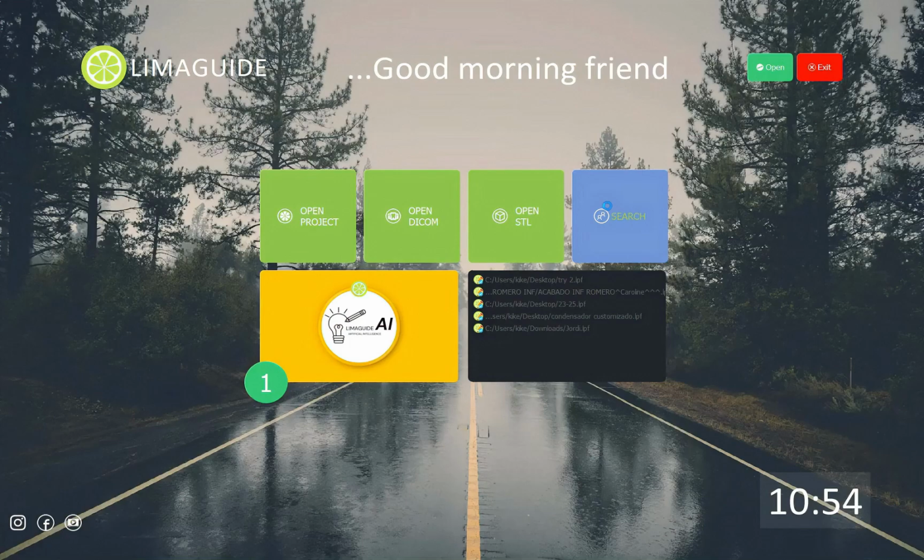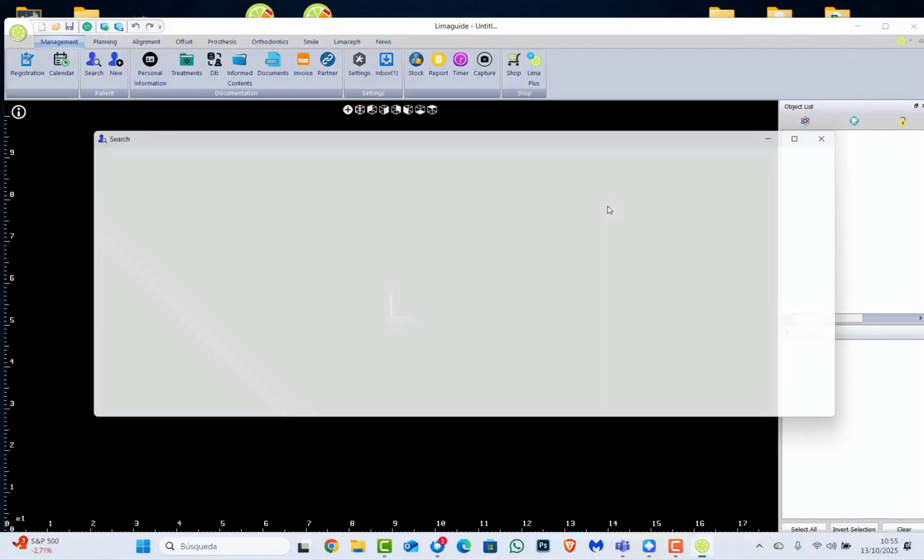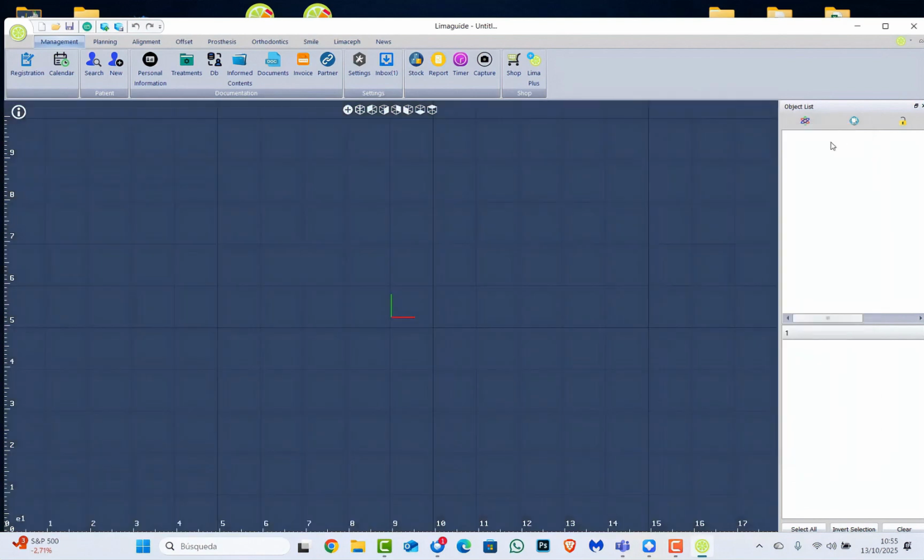We can already have a library we like from another software, and we can just export it as an STL. We can also use other teeth previously created by ourselves on Limaguide, teeth that have been modified, for example. So we can just export all of that as an STL file. With all of those STLs, we'll be able to create our own personalized library. Or even if a friend sends us their own personalized library, we'll be able to use that as well.